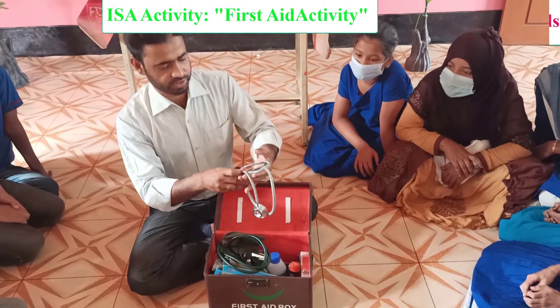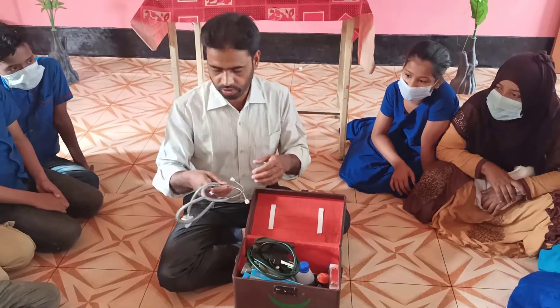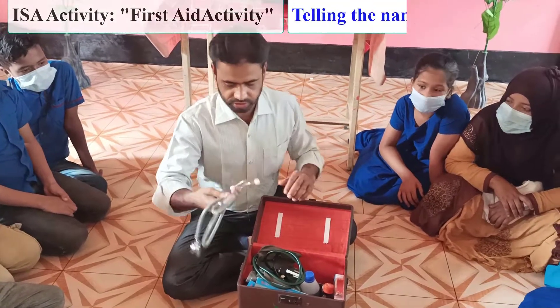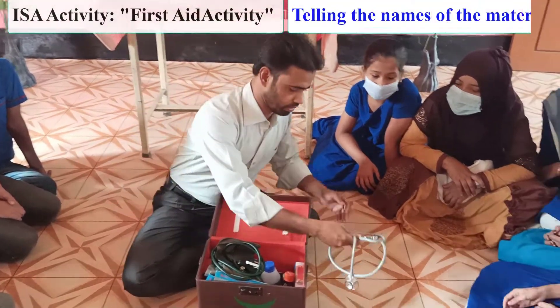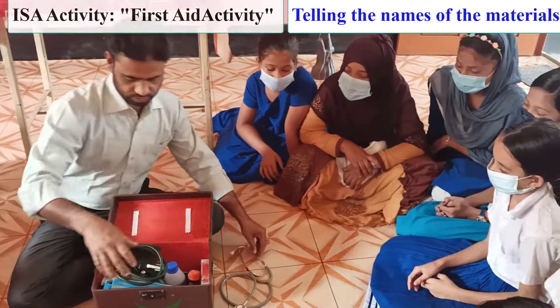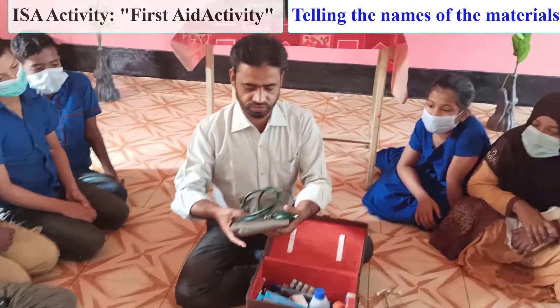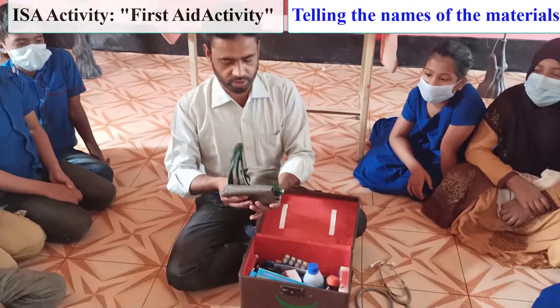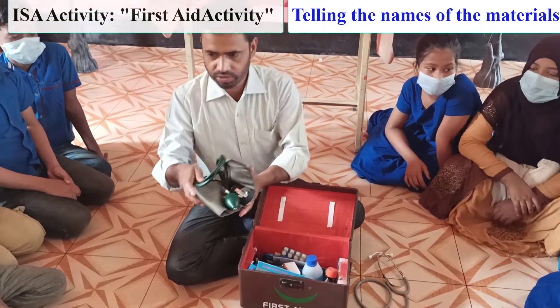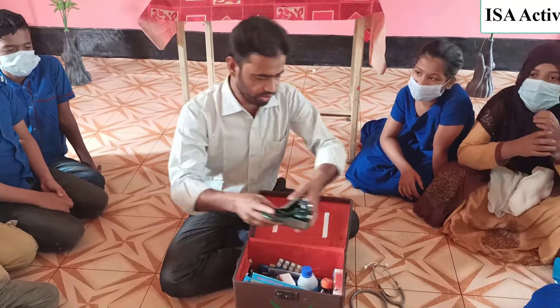This is a stethoscope. What is its name? Stethoscope. And it is a sphygmomanometer. What is its name? Sphygmomanometer.